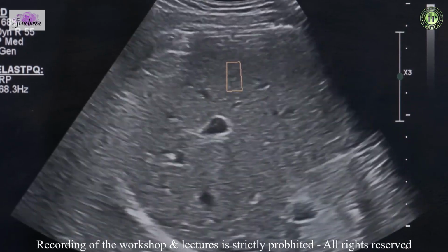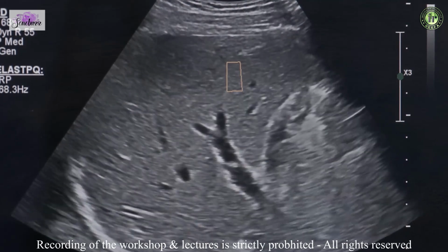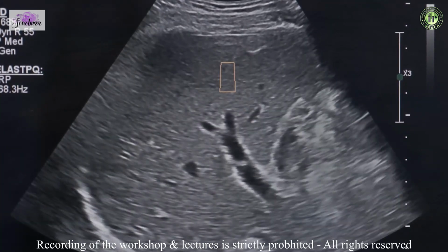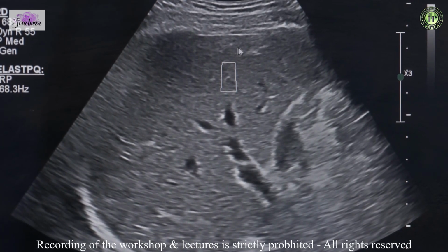Now the placement of the box is very important. There are a couple of things that we need to keep in mind. The first thing is, before we take the reading, we ask the patient to do a quick breath hold. Okay, hold your breath. Okay. So now that I have placed the box over here, there are a couple of things that I'm going to be looking at.